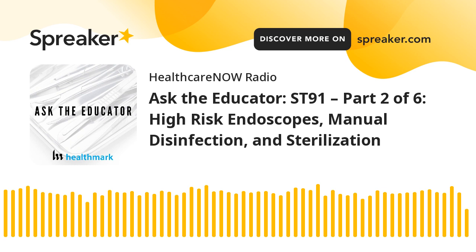So we wanted to give facilities the ability, if they have specific types of patients, it might be, just as an example, those undergoing organ transplants, where they're in a very precarious position as far as their health and immunocompromised status goes. Or it might be that you're doing a certain procedure that maybe other facilities aren't doing, where you would want to classify that scope differently. So you do have that ability to add any other types of scopes on as high risk within your facility.